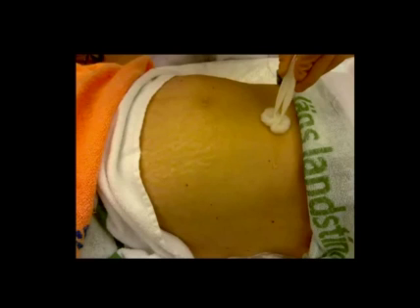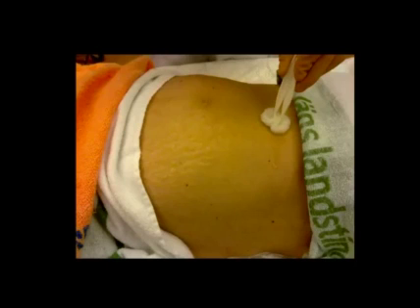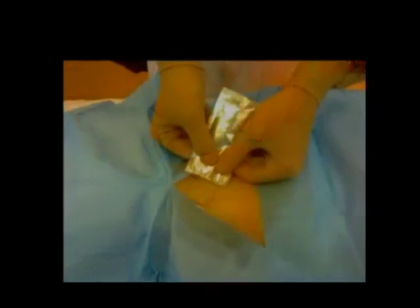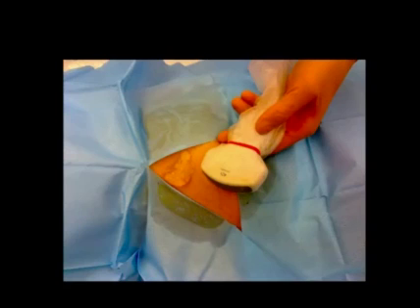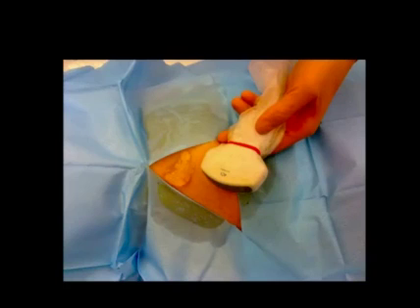Once all equipment is prepared, it is time to set the stage for the procedure. The patient will be lying supine on the operative table. The upper right abdominal quadrant will be scrubbed with disinfectant. Remember that this is a procedure that can be safely performed at bedside, even in an intensive care environment. Sterile drapes should be placed to delimit an operative field as small as possible, and some sterile ultrasound gel should be placed on the operative field. The ultrasound probe should be clad with a sterile cover. Considering that the tube is to be inserted with a craniocaudal angle, the operator should position themselves accordingly. The anesthetic should be injected first in the skin and subcutaneous fat, then in the muscular layer and in the parietal peritoneum, best done under ultrasound guidance.